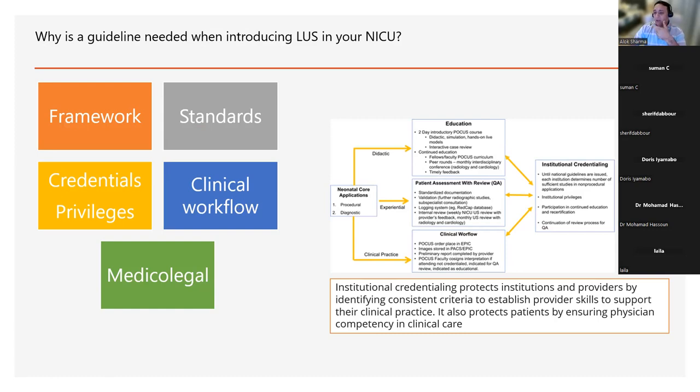And really, I'm giving you a simple example that if you review the same paper notes with those images after 5 years, paper undergoes attrition. So when they're kept in a large set of notes, the quality of the paper disintegrates. And actually, if you have to review a scan that far back and you don't have a clinical workflow which can save clips in lung ultrasound, then actually there is a risk, especially if you're trying to demonstrate a pneumothorax.